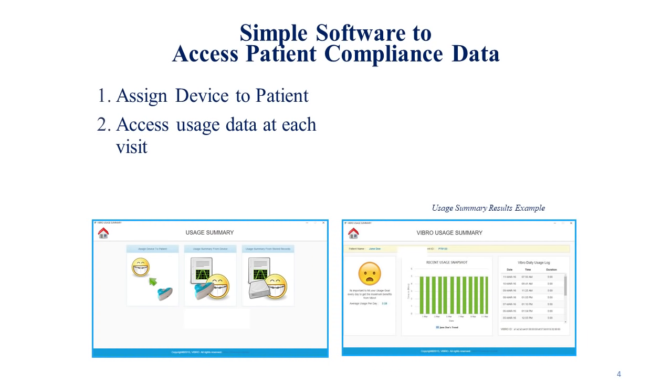We keep a USB cable plugged into the computer at the front office. Every time a vPro 5 patient comes in, they automatically hand that to the front desk. The front desk downloads the data. We print a PDF of the bottom right screen, and we attach that to the chart. So when I am in the back office and I see the patient, it's already attached to the chart, and I can see their compliance immediately.